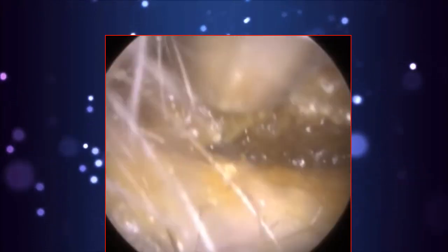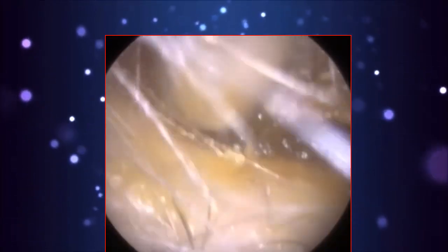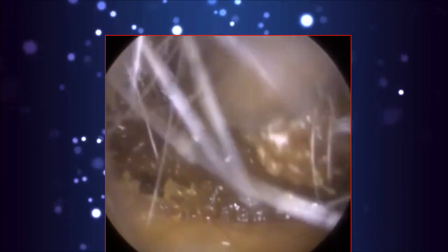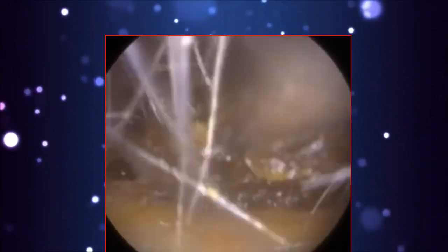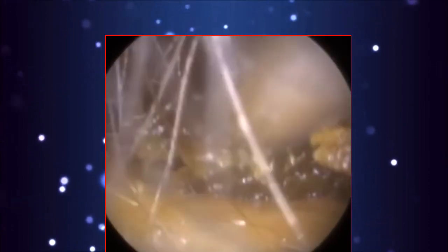From the entrance of both ear canals to the eardrum. We're just starting off on the left ear here. What made this procedure a bit more difficult than your norm is that the patient's ear canal, at least at the entrance, is somewhat collapsed.